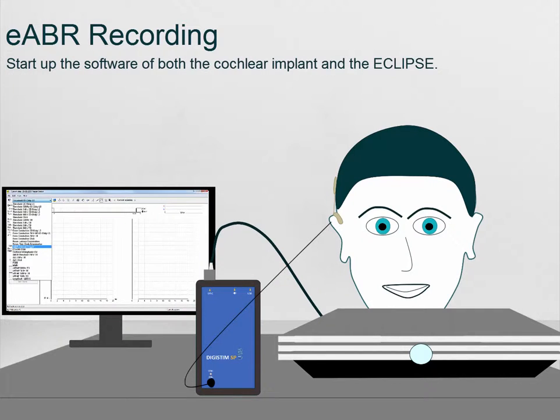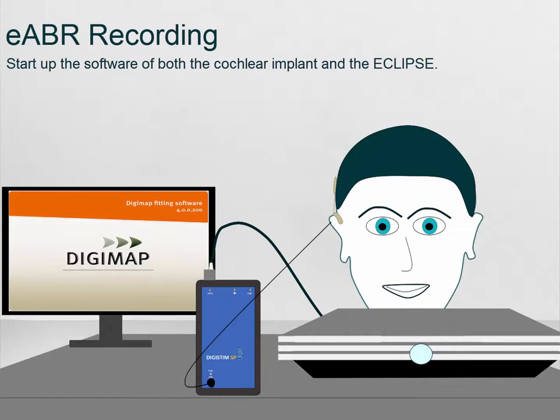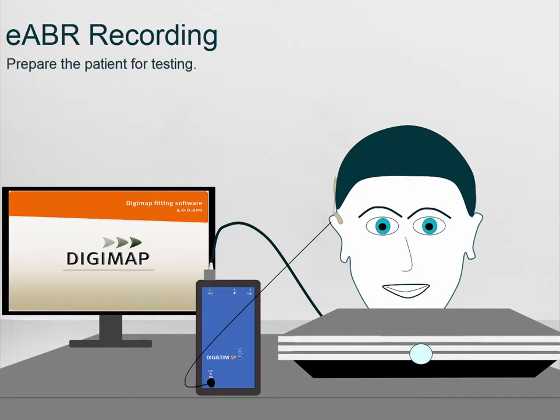Thirdly, start up both the Evoked Potential software and the software provided by the implant manufacturer. Next, ensure the patient is connected properly with the appropriate electrode montage.